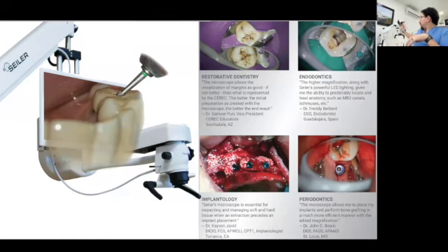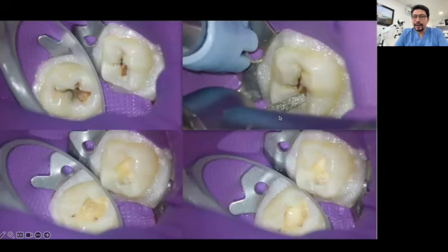With the regular microscope that you can see here, it is not that easy. You need to stay in a straight position, and you cannot angulate the microscope because it will generate an angulation of the binoculars as well, and you cannot adapt the angulation that the binoculars will take. And we will see all these differences during the next slides.